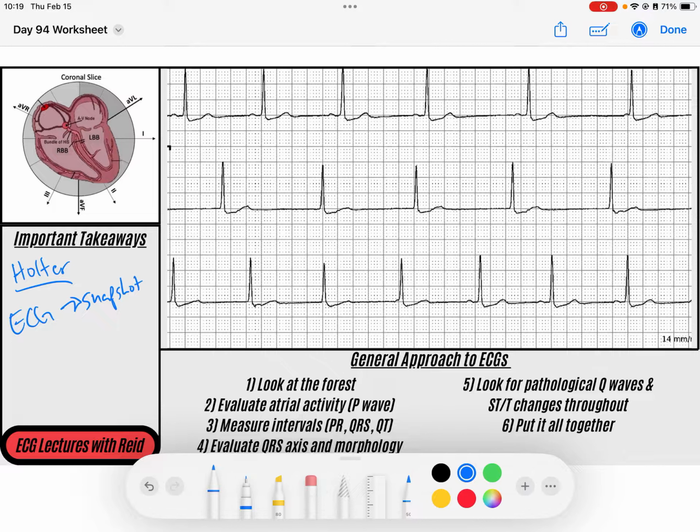So this patient, you're evaluating their symptoms, you're trying to figure out what's causing their lightheadedness or their chest pain or whatever. A Holter monitor can be great because we can do this up to 14 days maybe, right? Depending on how long you think you need to have this person wear it to capture the event that you want. If they're having daily episodes, then maybe just a couple days. And so it'll record these rhythms, and I think they're really helpful because they can help us kind of tease out maybe some of the physiology that we're dealing with.